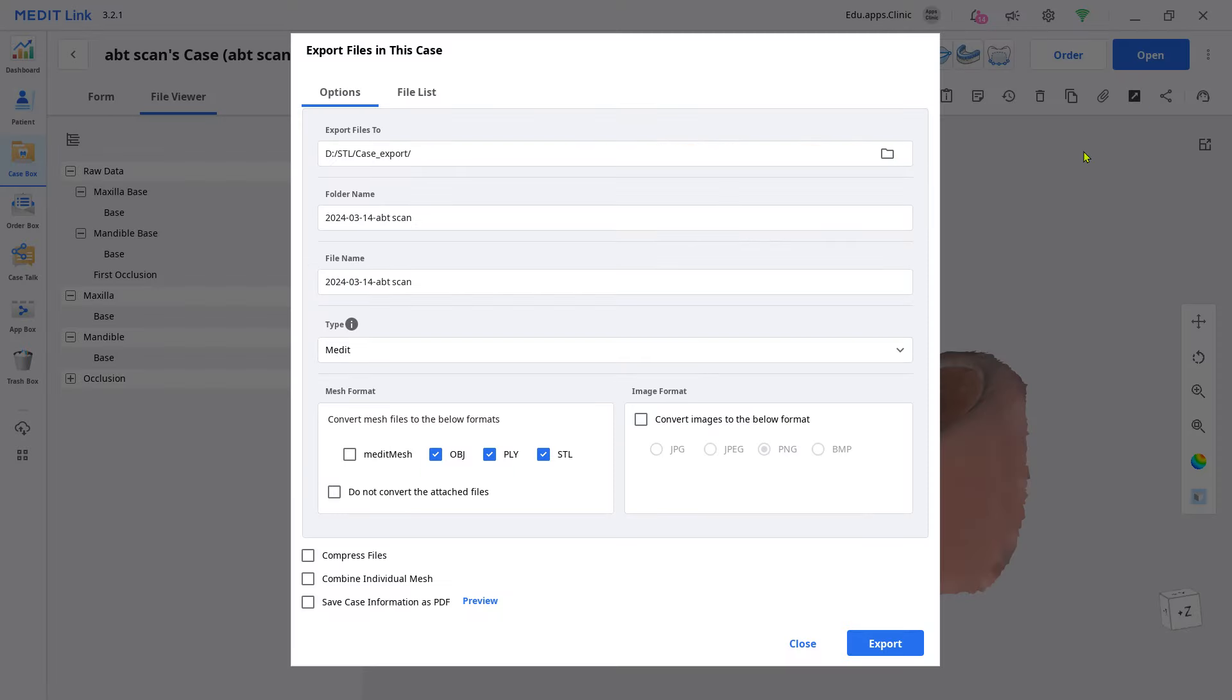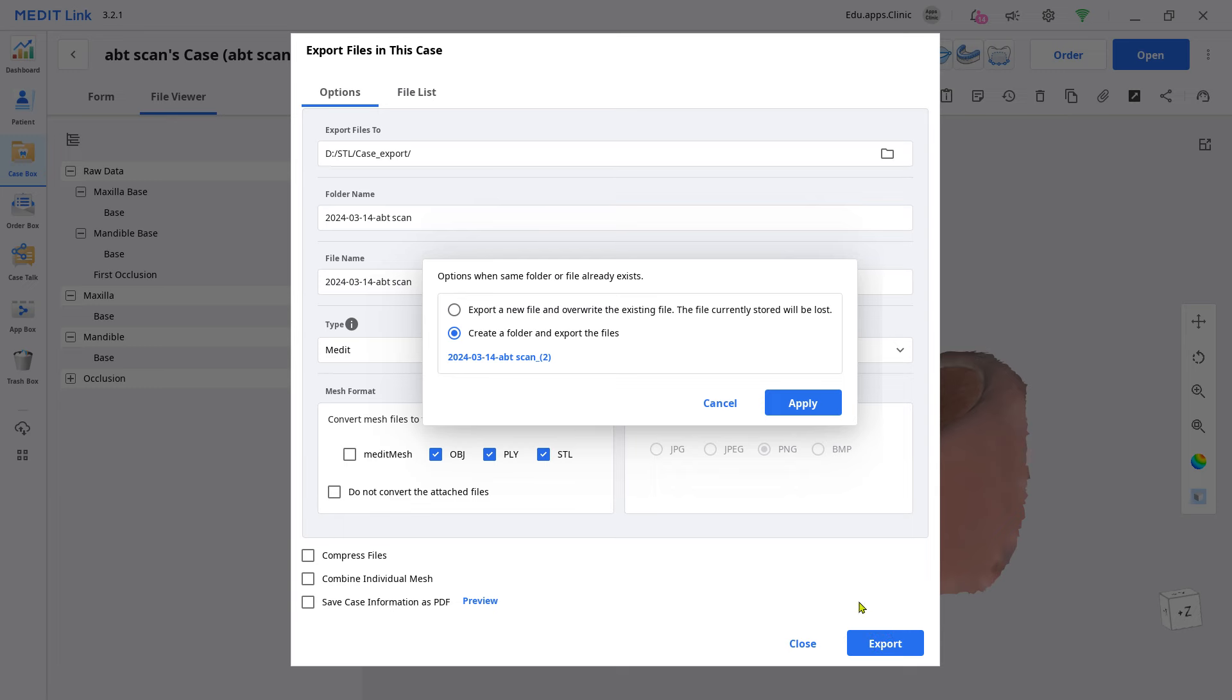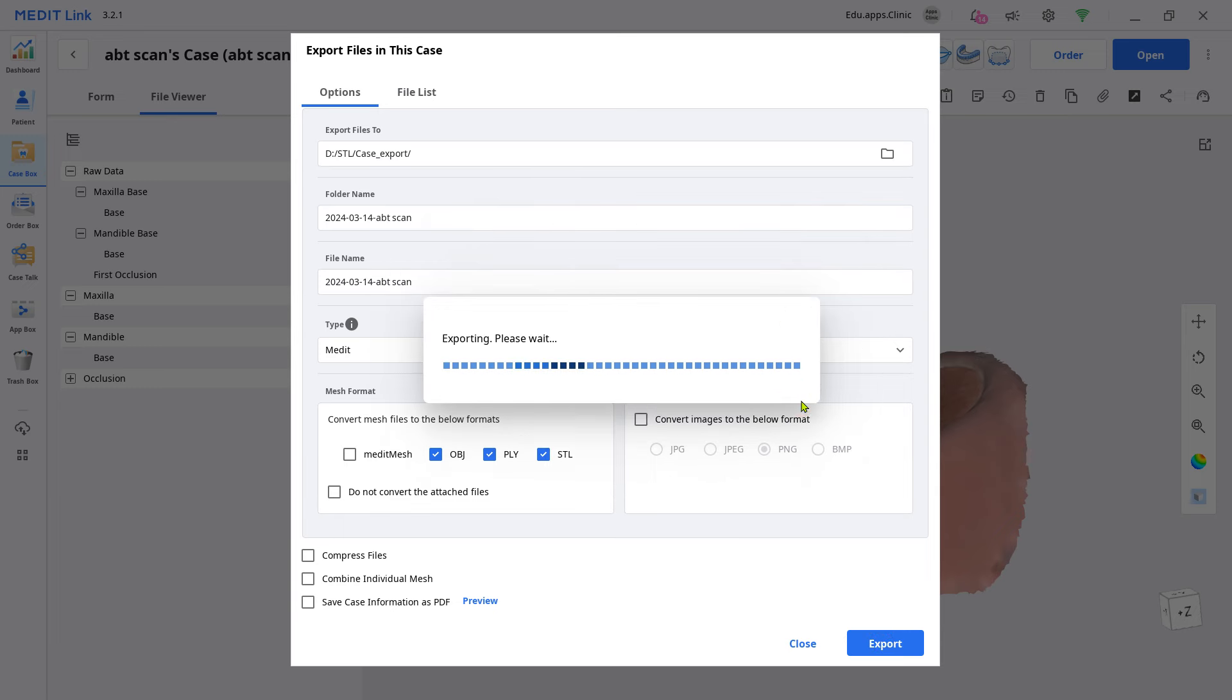Note, when you send the case, let the lab know which abutment is being used. Then they will do the CAD crown design work by matching it to their abutment library.